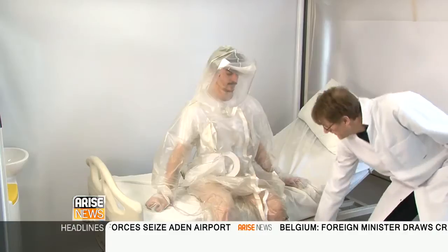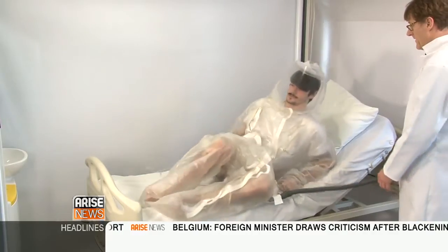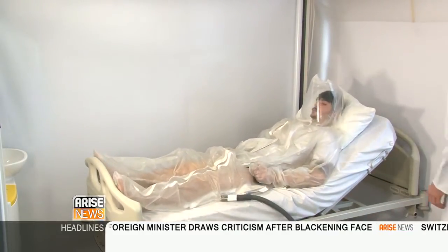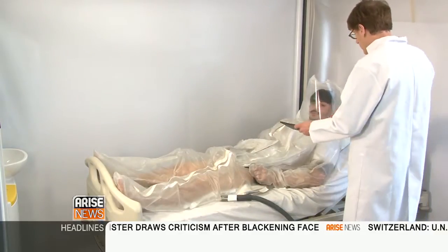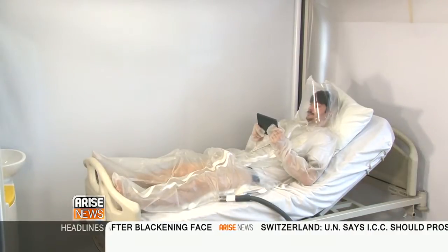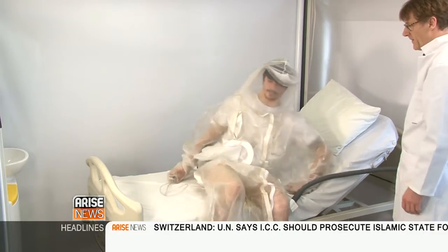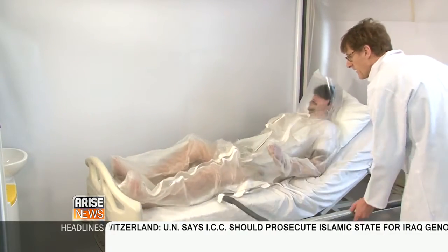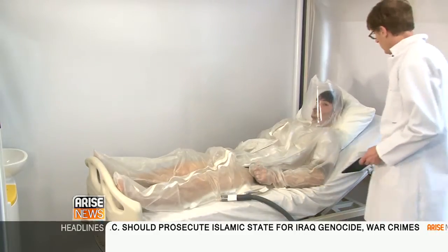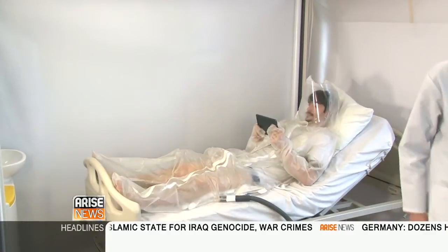So the situation here is that we've looked at isolation systems with the Department of Health and the NHS for a number of years. And this suit is an approach to turn the problem on its head and say, well, actually what's been one of the major difficulties is protecting the care workers whilst looking after the patient. So how do we make sure the patient is well cared for, but give extra protection to our care workers?